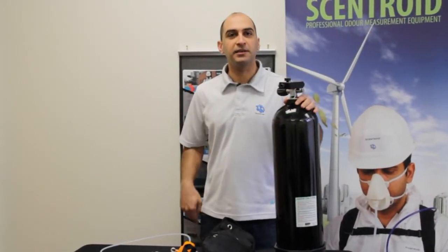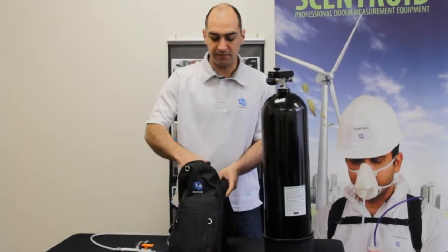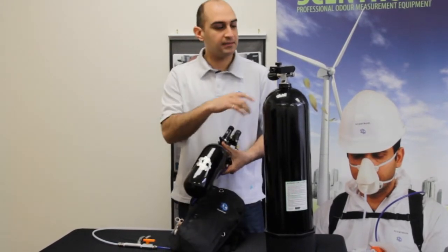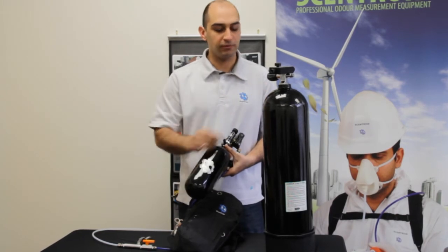Hi, this is Adam from IDES Canada. Today I want to make a quick video to show you how to fill up your SM100 using a scuba tank. You can use the SM100's little tank and fill it up at a scuba shop directly, but it's a lot more convenient if you have a scuba tank with you to be able to fill it up.